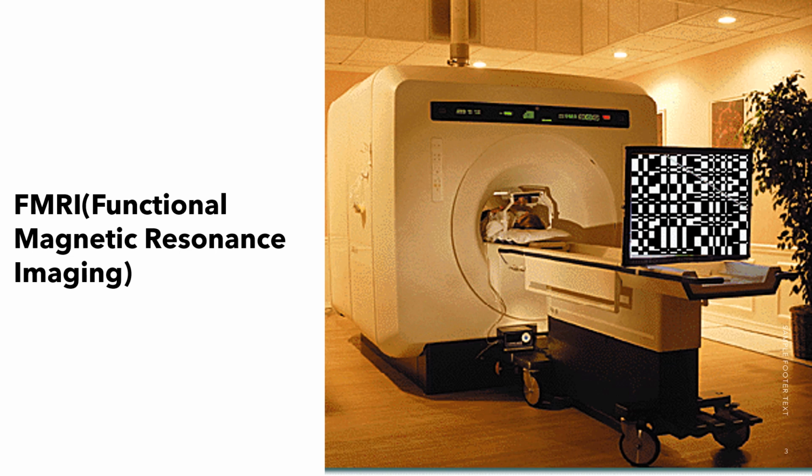The best part, and the most important part, is that fMRI is a non-invasive and safe imaging technique that does not require ionizing radiations, making it a very, very important tool for diagnosing and treating neurological disorders.